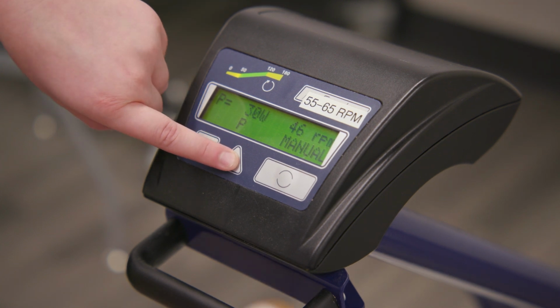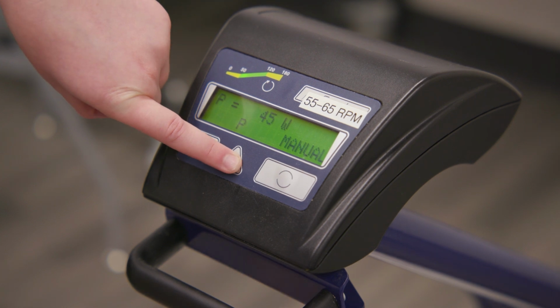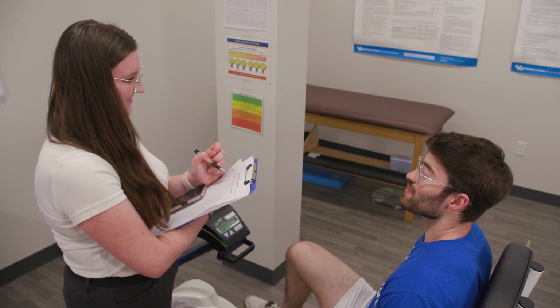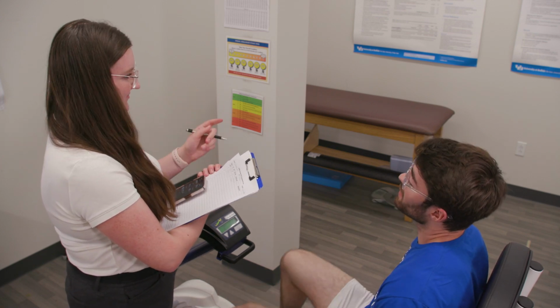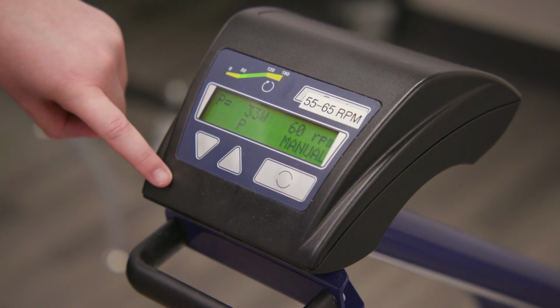Once 1 minute has elapsed, adjust the power output to the wattage for stage 2. The patient must continue pedaling at 55 to 65 RPMs during this transition and through every 1-minute stage. As the test continues, the watts will increase at each stage in proportion to the patient's weight. Continue recording heart rate, VAS, and RPE during each stage and increasing the intensity of exercise until the patient meets the stopping criteria. Once the test is over, reduce the power output to the starting level.